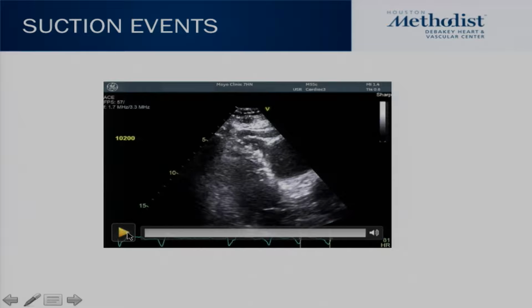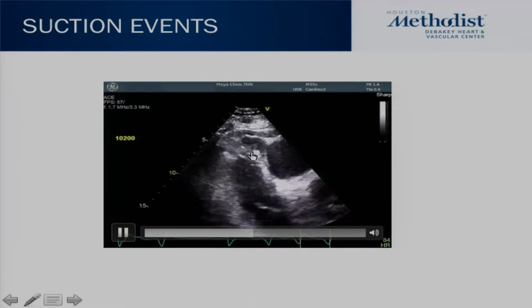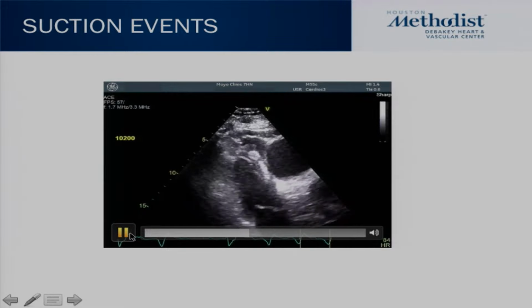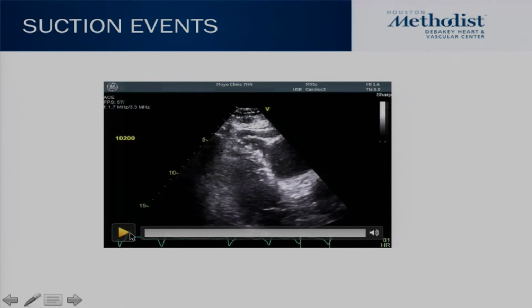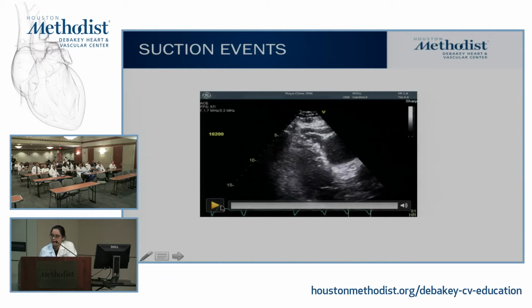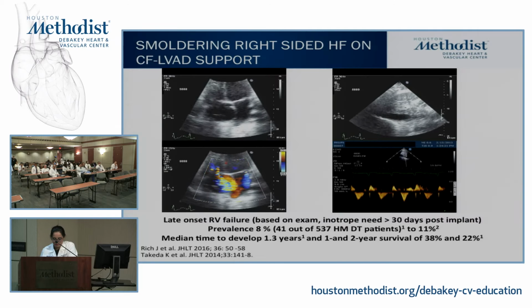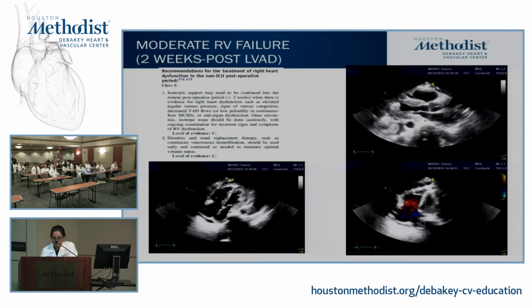This is like the mother of all suctions, because you see this whole wall, because the inflow cannula is pointing this way, and this is the myocardium, and the entire thing gets sucked in. So part of it depends on the size of the LV, but also on the location of the cannula. During placement of the cannula, does the surgery usually proceed with imaging?